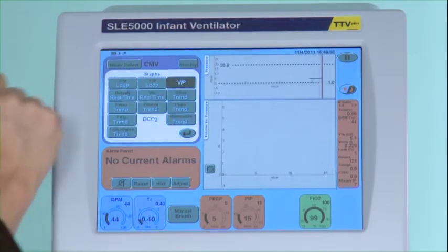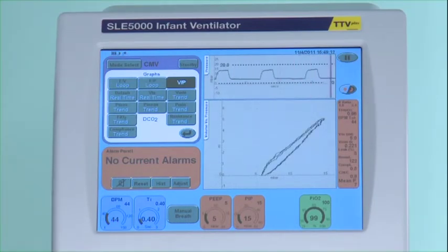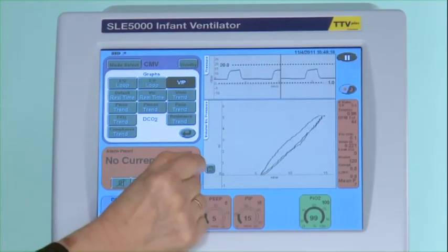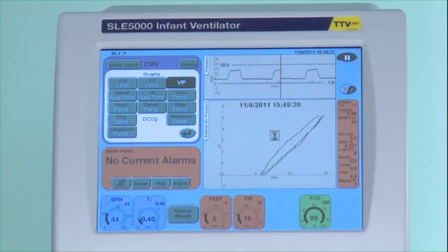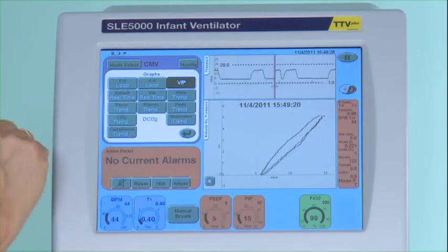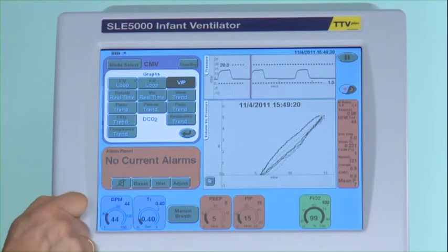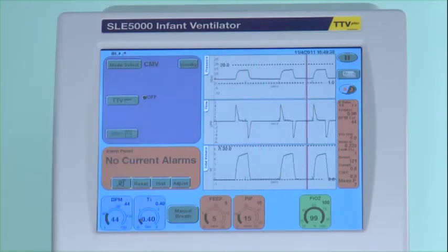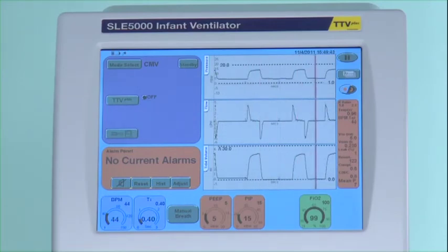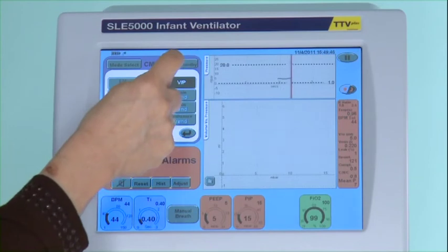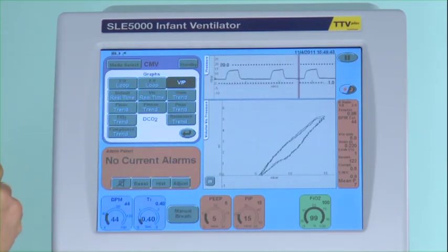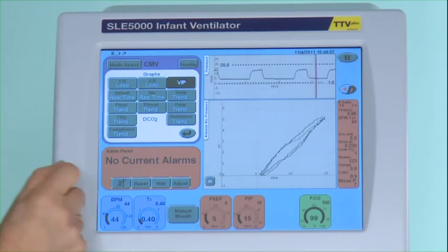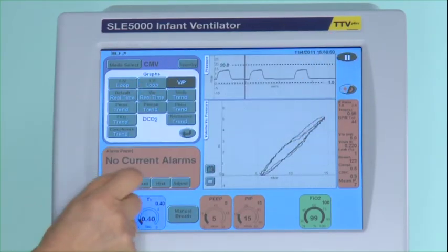If while you are looking at a volume pressure loop you may want to take a picture, you can do so by pressing the pause button — the camera icon appears. Press the camera and the picture is taken and stored in a folder. Go back to ventilation and at some other time you can recall that folder and see how it compares to the current view, bringing up the original and new curves overlaid in red and green. You may then wish to take a picture of the current loop and so on.